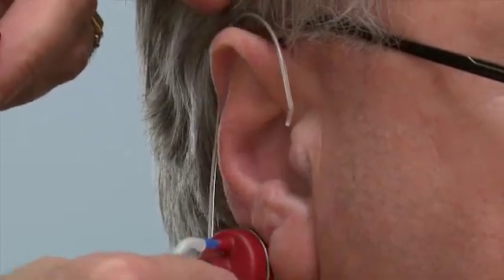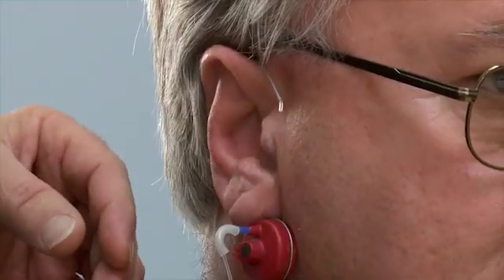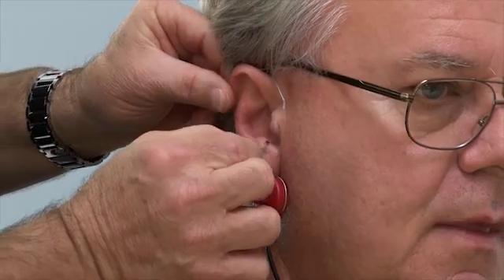So that's what we're going to do now. So right now what I'm going to do is I'm going to set this in your ear. So we're going to put this up on the ear. I already took the hearing aid out. I'm going to take the tube. This is the probe mic. I'm going to slide that up in the ear canal. Now we're going to take the hearing aid because the microphone is right here. We're going to slide the hearing aid in the ear.